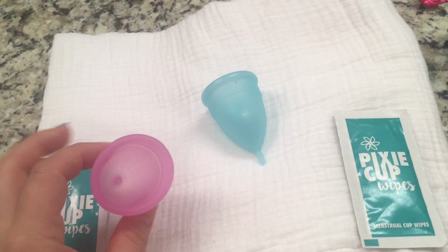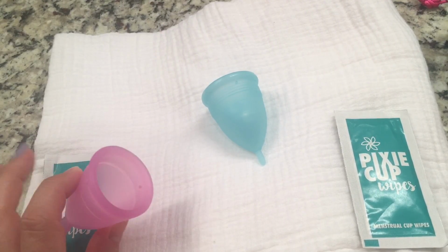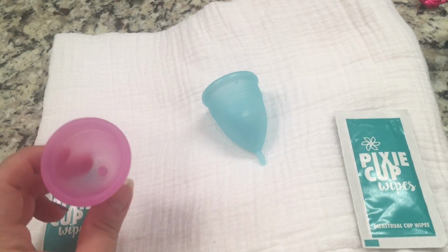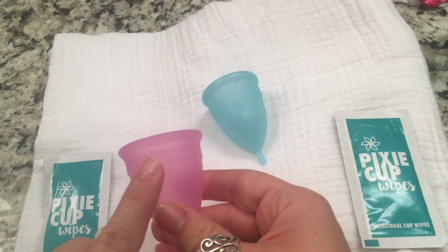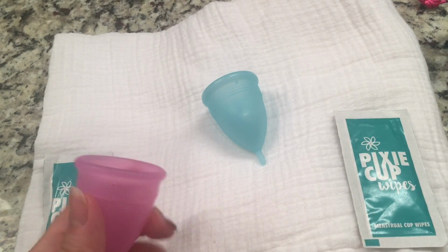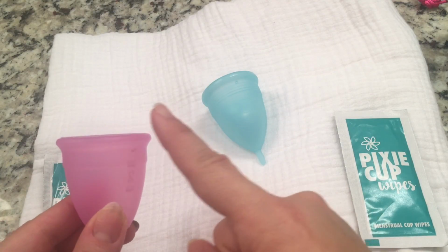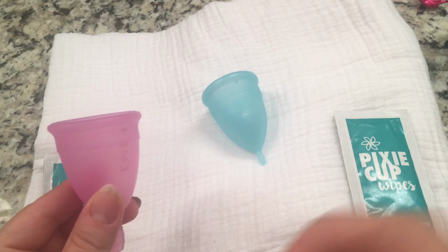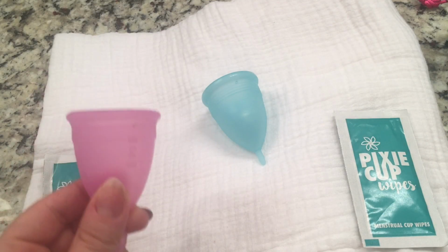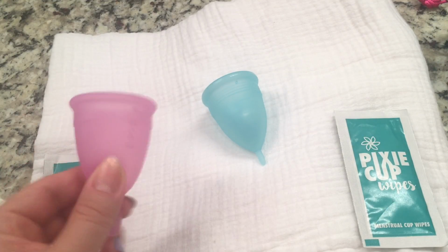So the way I insert it that I found was easiest for me: the only thing that's really awkward about this, if you've worn tampons before, is obviously it can't fit like this in your body. And if you notice, these have a little hole here and a little hole here, and this is to help the suction. Because obviously if you're wearing this but fluid can still get around the sides, then you're still going to leak and you're going to get stains in your underwear and things like that. So it wants to make sure that there's actually a seal. And sometimes you'll hear it actually make a little sucking sound, and then you know it's in place.